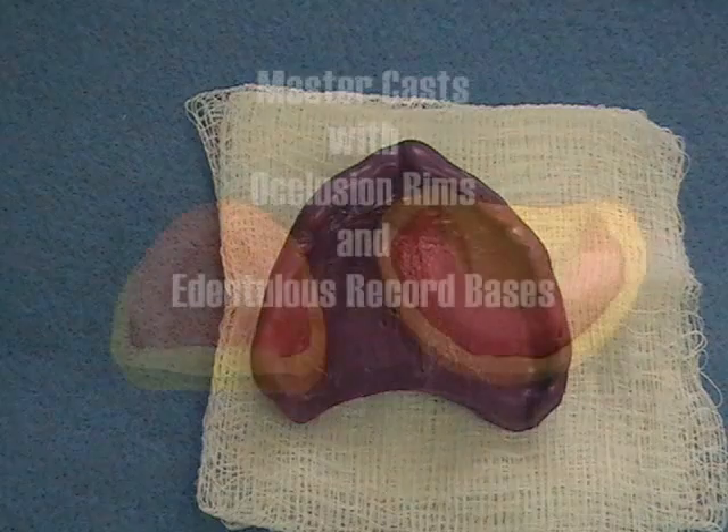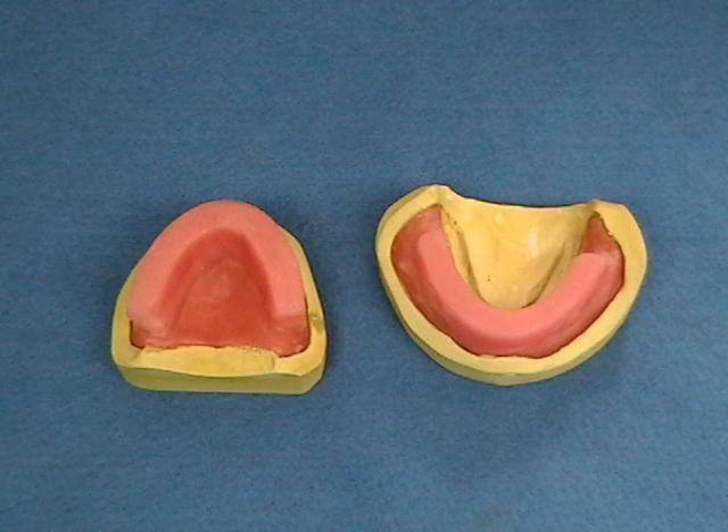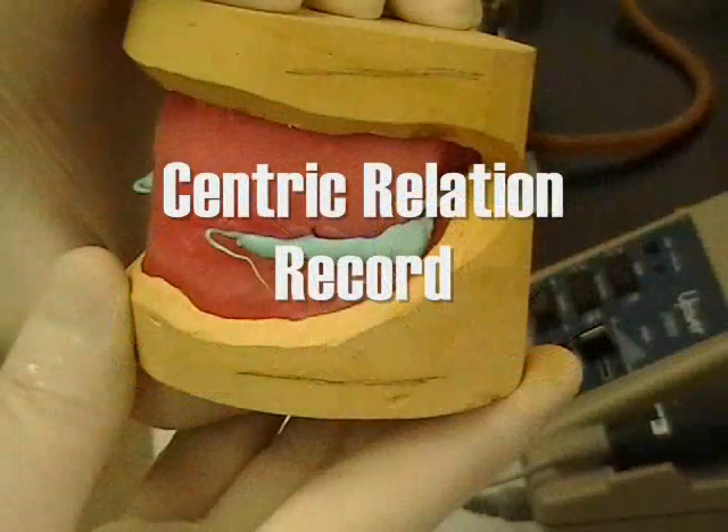Master casts are fabricated and ready for recording the patient's maxillomandibular relationship. A record is made at the proposed vertical dimension of occlusion.